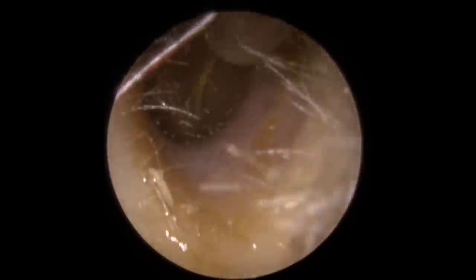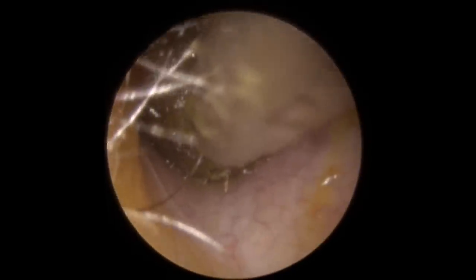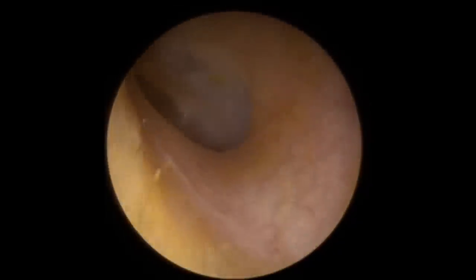Just blocked the end of the suction, so we'll clear that out and go back in again. Still a little tiny bit of skin there. Now we're starting to see the movement — it's on its way out now. Just got to get a grip, a bit of wiggling and this should work its way down the canal. You can see it's hit a kind of narrow section — it's a little bit stuck to the sides. A bit more of a wiggle, trying to get a good enough grip on it, just gently rocking it up and down. And there we are — that's the blockage. We'll take a look behind, and there's the eardrum there.